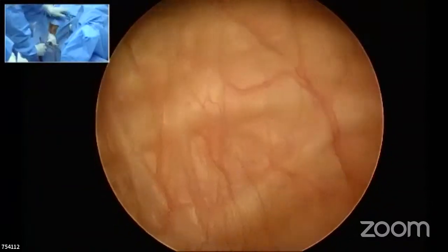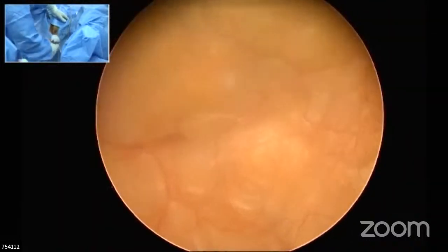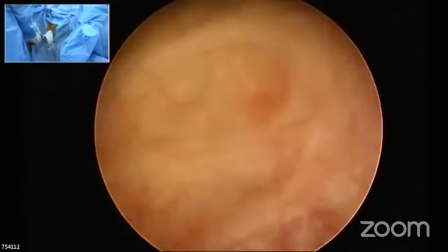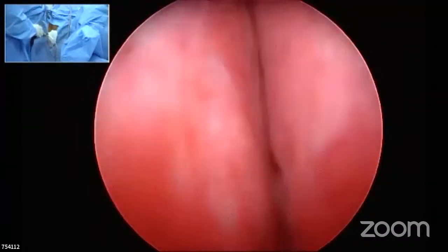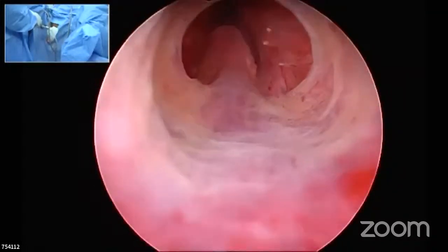And I see the bladder. Look for any bladder tumors anywhere, the anterior wall of the bladder, and trabeculations inside the bladder. So a good cystoscopy is necessary before any resection is started. Don't rely on ultrasound alone and think that everything is fine inside the bladder. You may miss many things happening inside the bladder.